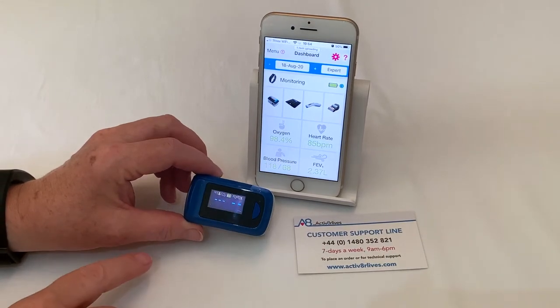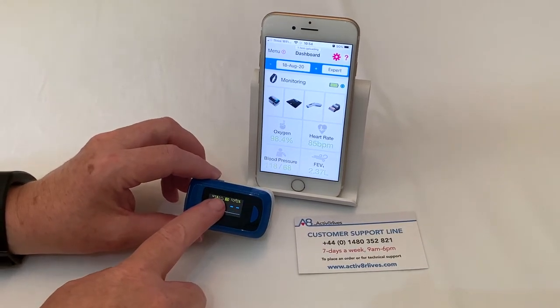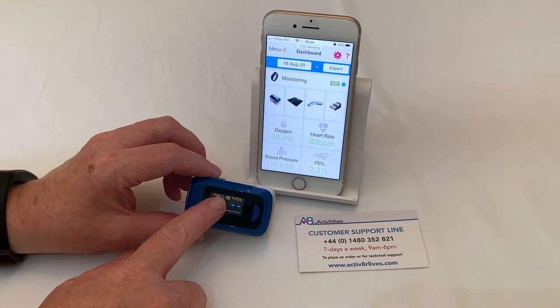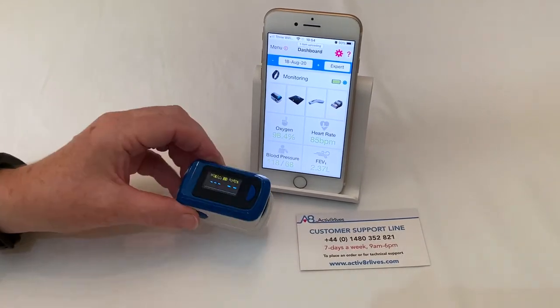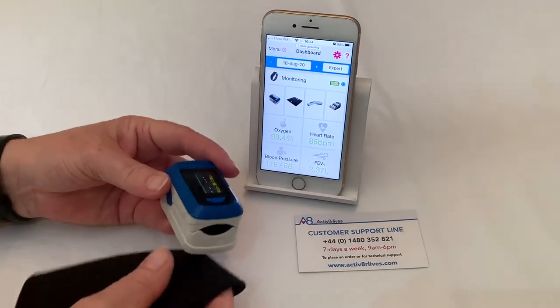To check if there is enough battery power within the batteries, on the LCD you will see a battery symbol. If it has no bars in it, it means that the batteries are depleted and you can just replace them.